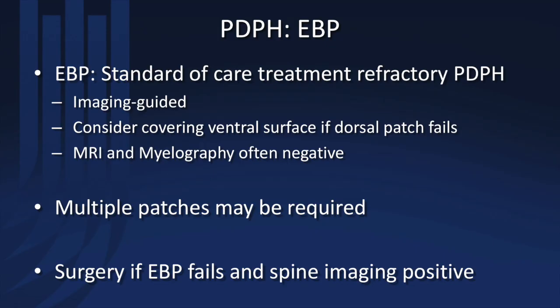And then finally, multiple patches may be required. We've had plenty of situations where you get incremental progress, and then send the patient to a surgeon if it fails, particularly if the imaging is positive and you find a dorsal bleb.